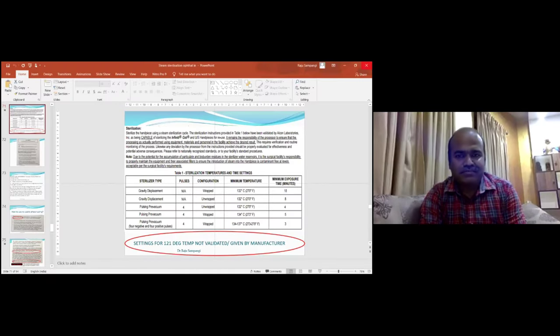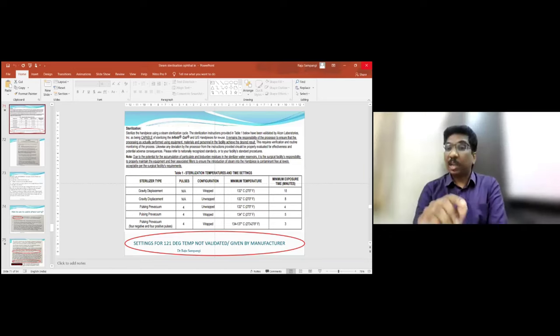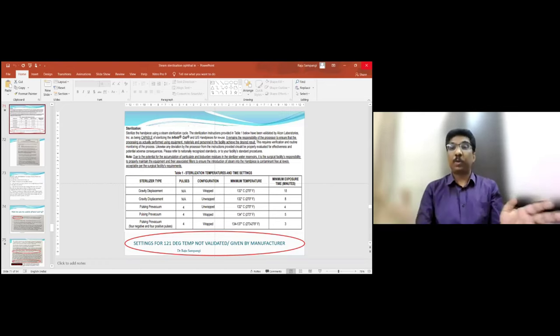And one of the standard objectives is to follow the manufacturer guidelines. Correct. If you are using an Alcon handpiece, follow their settings. And if you are using an AMO or another probe, use their standard guidelines. At least Alcon has given these timings and minimum exposure time. In AMO, they have given it very loosely, just 121 degrees or 132 degrees. They have not mentioned the holding time, or wrapped or unwrapped. Nothing has been given. So that is where the problem comes.